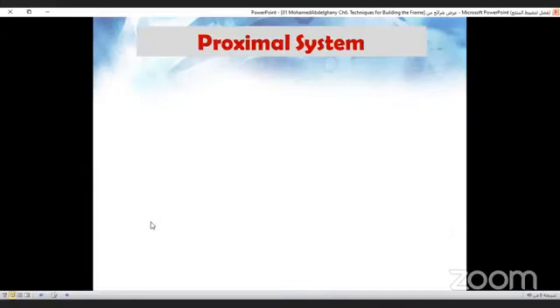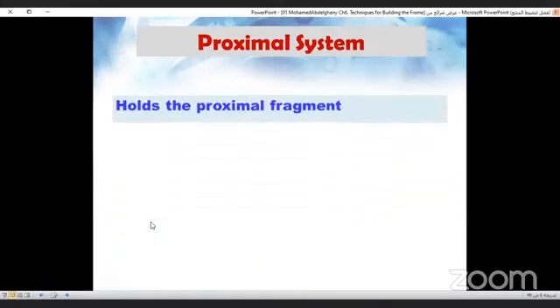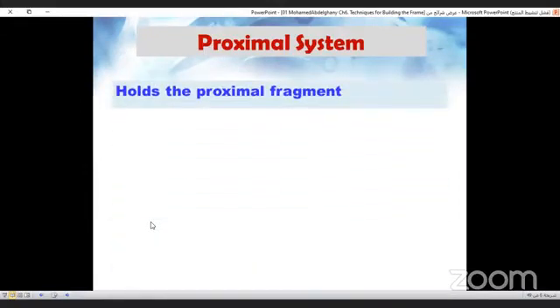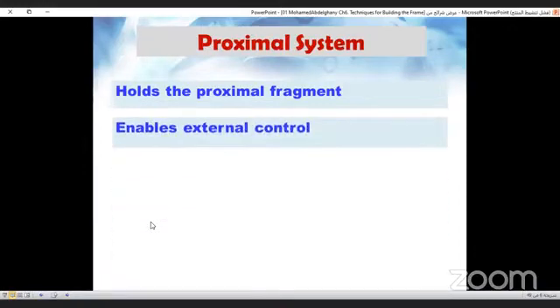We will start by the proximal system. It holds the proximal fragment, enables external control, and is composed of at least two rings.